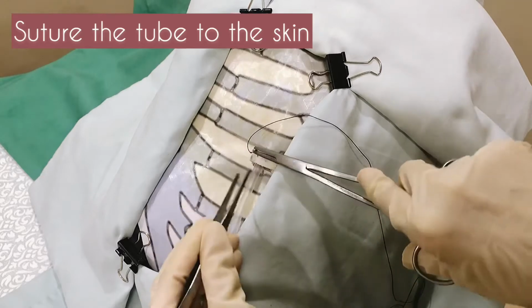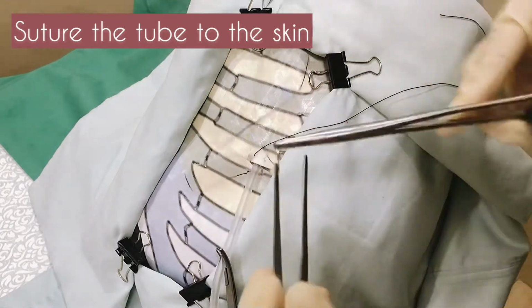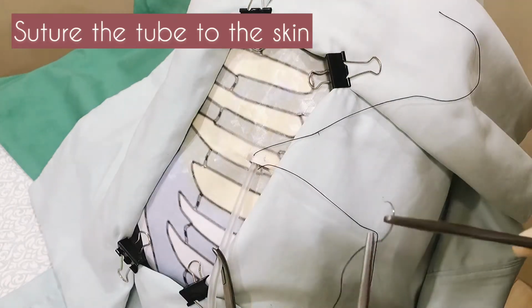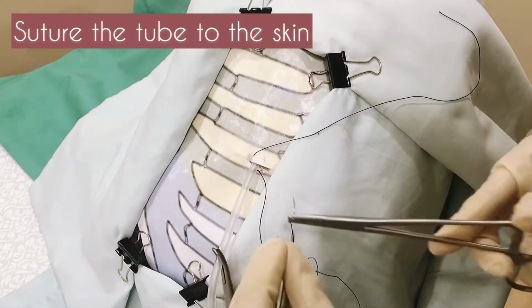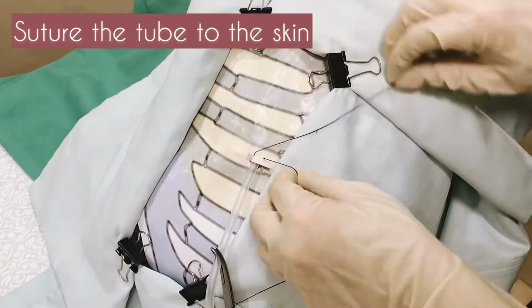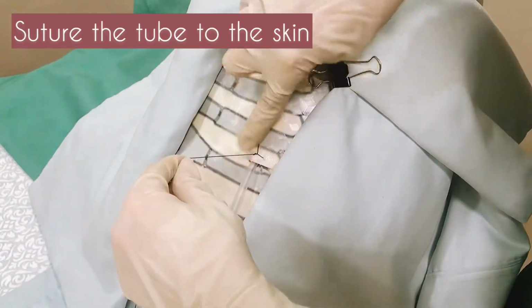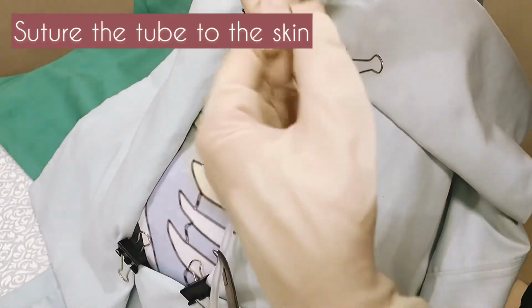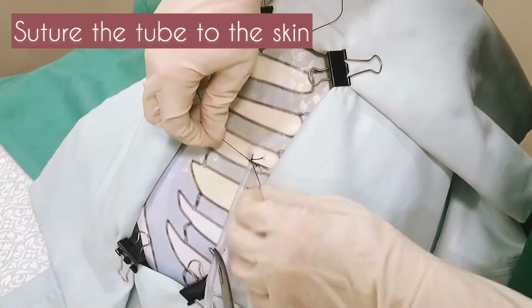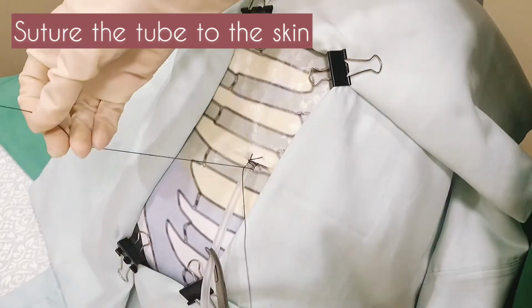Suture the tube into the skin with Silk Zero. Pass the stitch around the tube to close the wound margins. Tie the suture in place tight to the skin. Now, wrap the ends in opposite directions around the tube to form a series of X's.